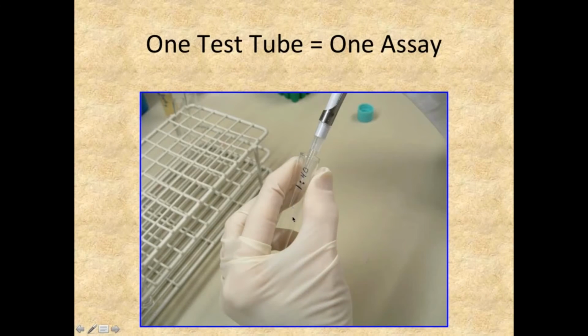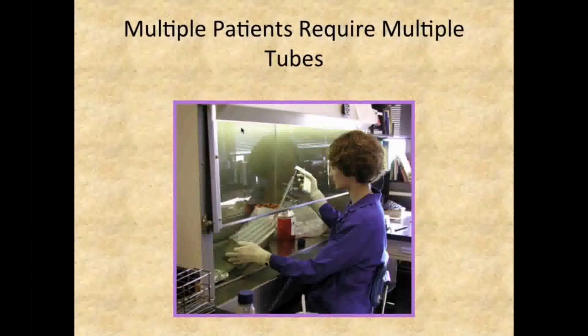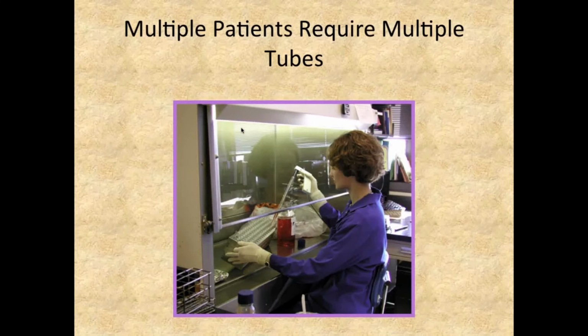Many lab tests are still done manually. Here we see the clinical laboratory scientist manually putting some drops into some test tubes here in a blood bank test. She's doing blood grouping and typing to determine the patient's blood group and type in a manual format. Here the medical laboratory scientist is pipetting using this device to remove a small amount, very small amount, less than a drop in some cases, of this particular reagent to put into a test.